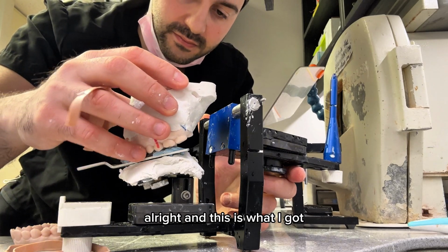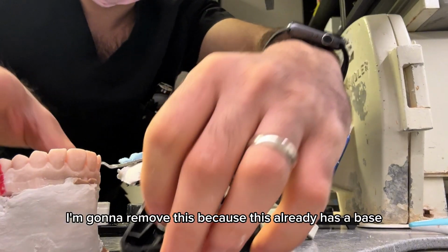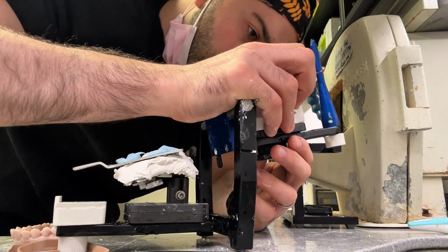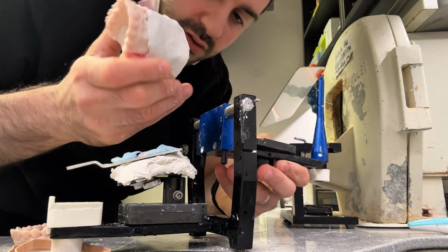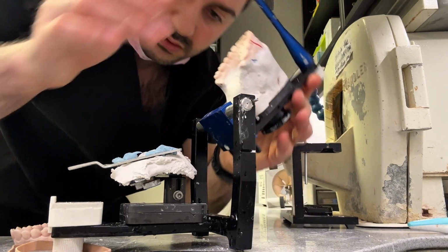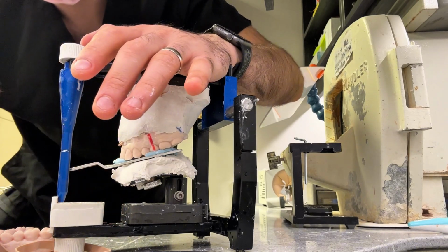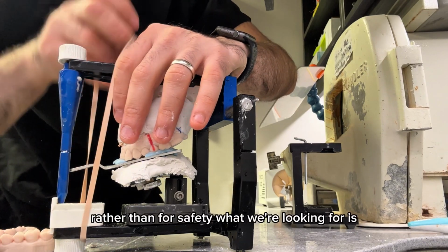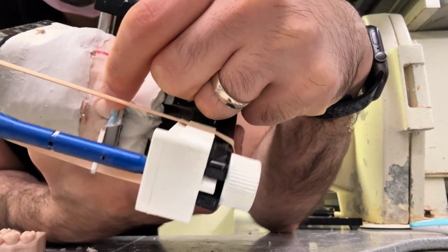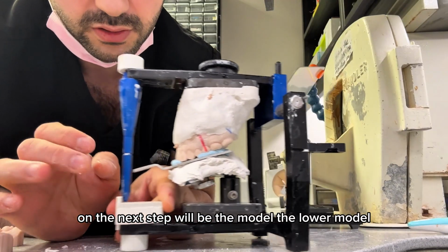Alright, and this is what I got. I'm gonna remove this because this already has a base. It's just a different color. It's white. I'm gonna clean this up. Rubber band for safety. What we're looking for is there's absolutely no gaps between the impression material and the plastic teeth. The next step will be to mount the lower model.